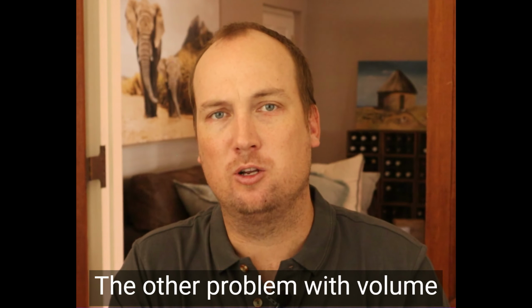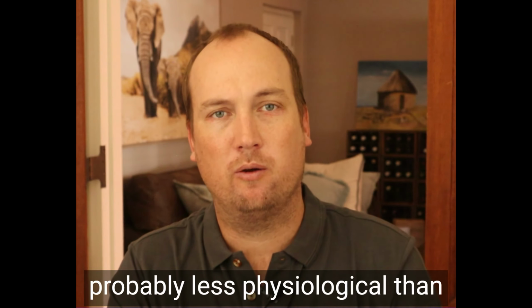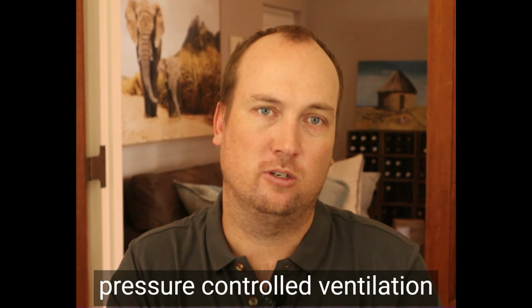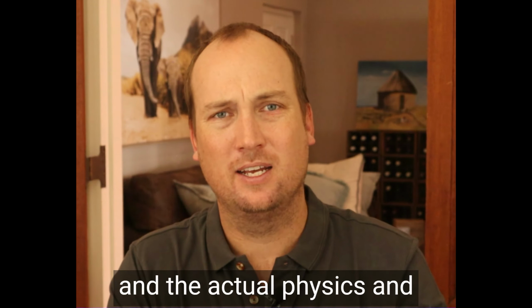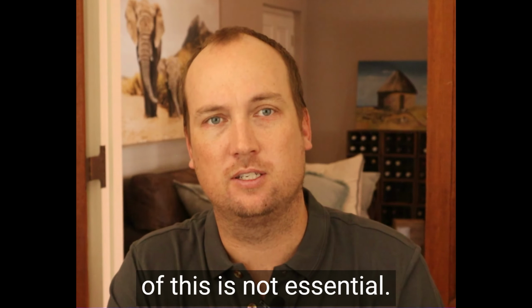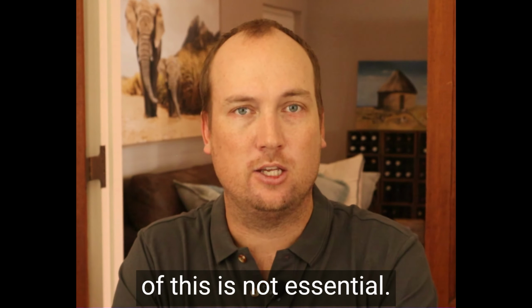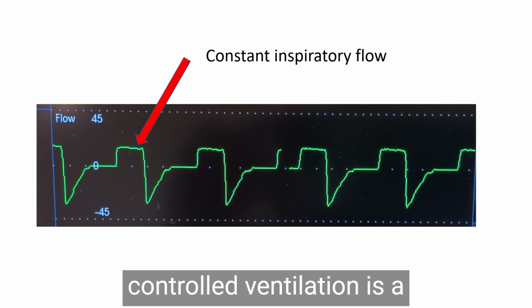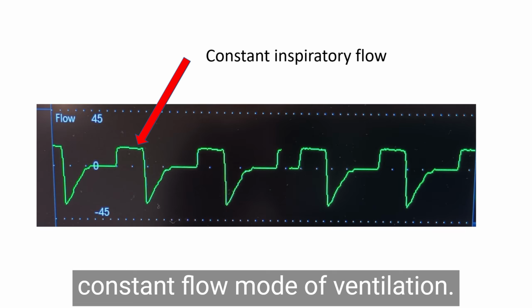The other problem with volume-controlled ventilation is it's probably less physiological than pressure-controlled ventilation. The actual physics and physiological explanation of this is not essential. The problem is that volume-controlled ventilation is a constant flow mode of ventilation.